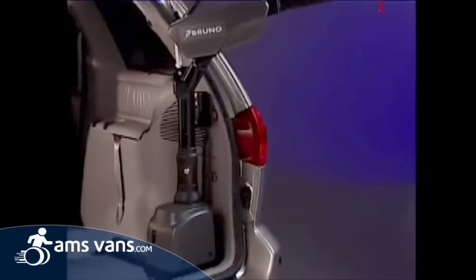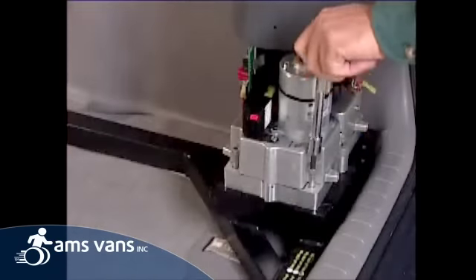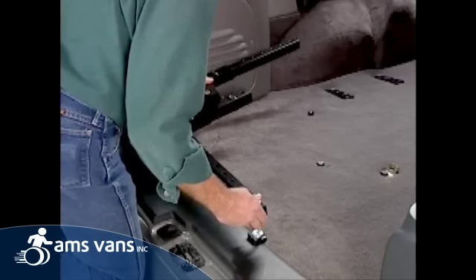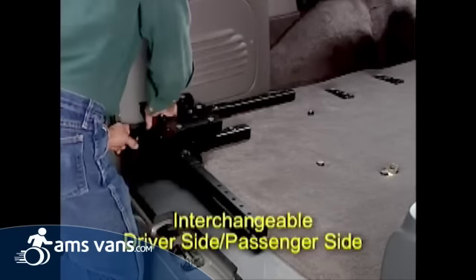All great structures are built from the ground up, and the Curbsider is no exception. Over 300 custom sub bases ensure the best mounting location based on specific vehicle integrity. The unique adjustable sub base not only provides flexibility to work around any mounting obstacle but is interchangeable between the driver and passenger side.